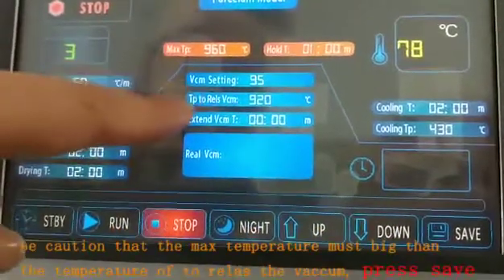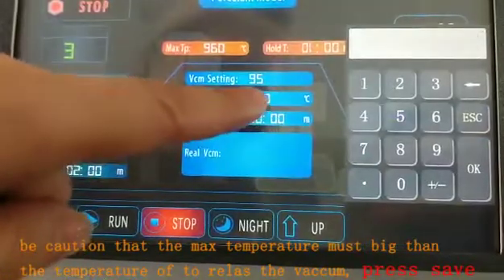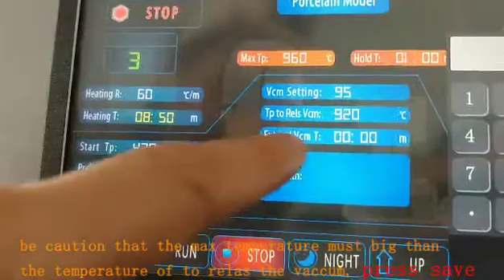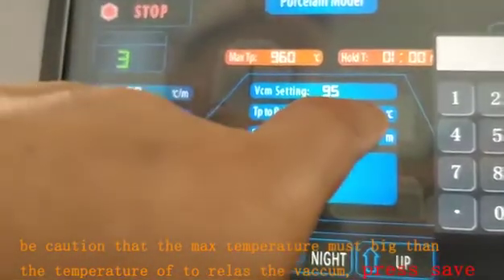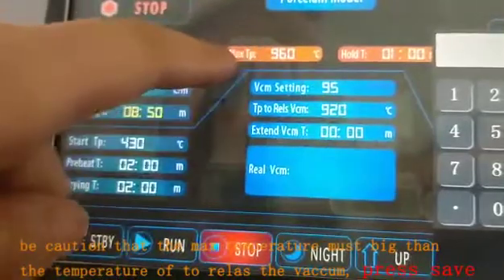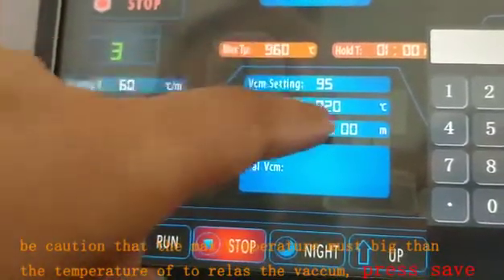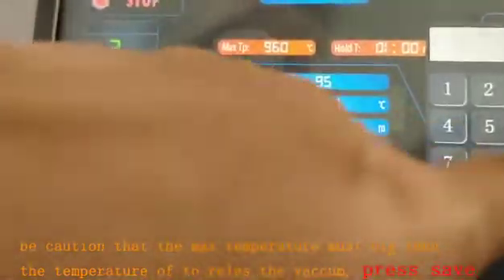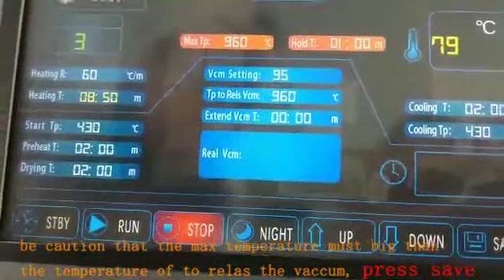You have to be careful: the temperature to release the vacuum must be less than the maximum temperature. For example, if the maximum is 960, the vacuum release temperature must be set smaller than 960.